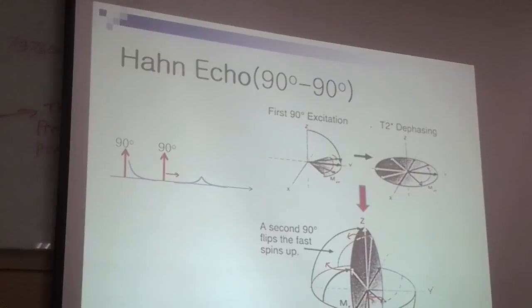Gradient echo is generated by the compensation gradient field, and the spin echo comes from the combination of a 90-degree RF pulse and a 180-degree RF pulse. Even though we use double 90-degree RF pulses, the spin echo also comes from this combination of RF pulses.